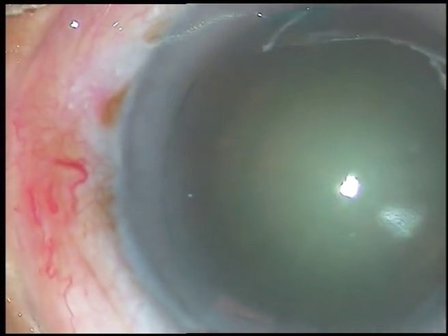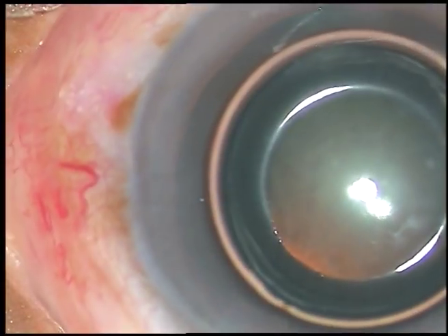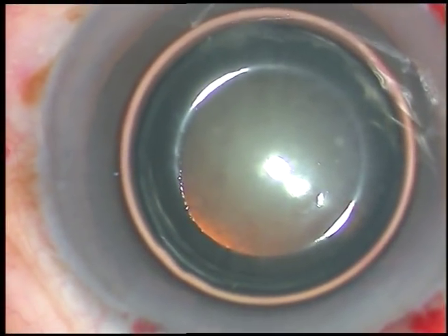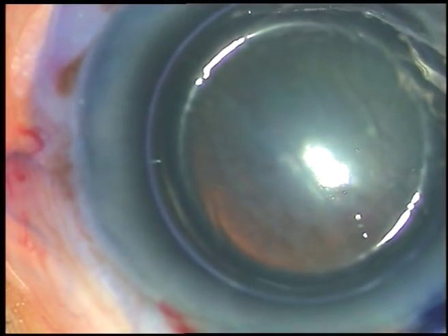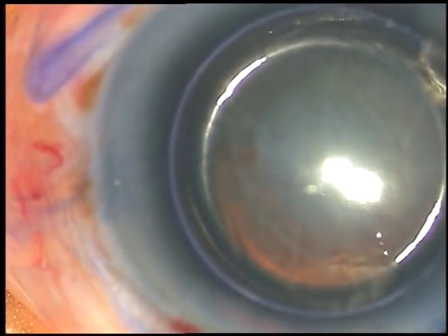Now in this case I want to show capsulorhexis also. Injecting an air bubble, and then trypan blue dye — trypan blue 0.06%. Spray it all over the capsule. There should not be any area unstained.